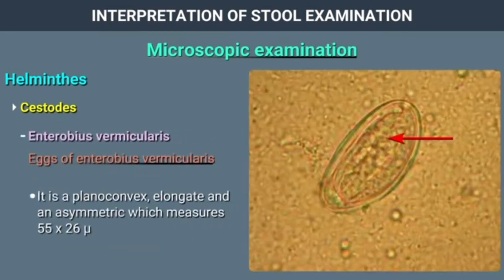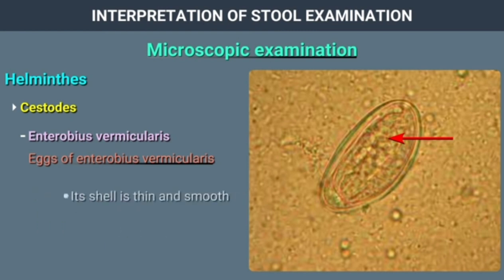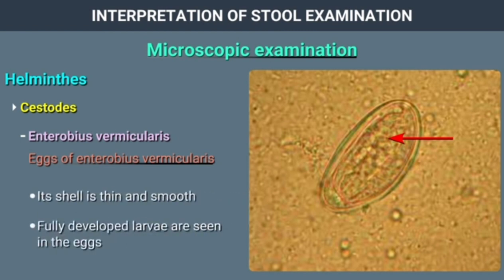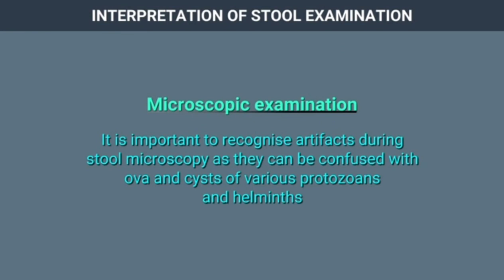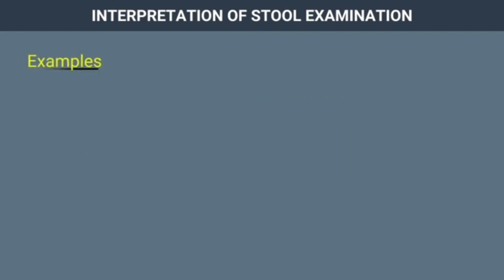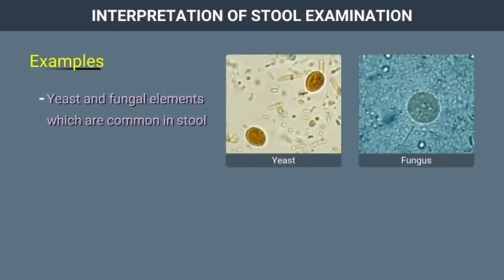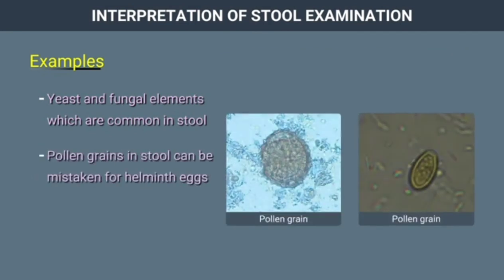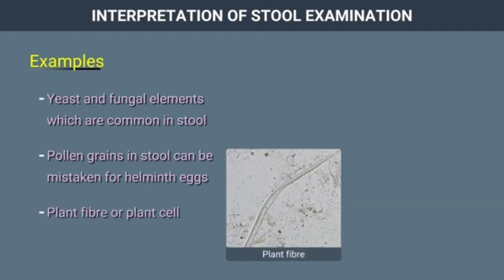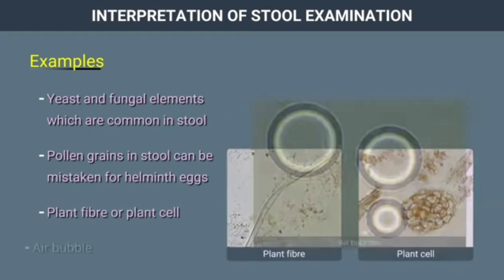Enterobius vermicularis: The egg is plano-convex, elongate, and asymmetric, measuring 55 by 26 microns. Its shell is thin and smooth, with fully developed larvae visible inside. It is important to recognize artifacts during stool microscopy as they can be confused with ova and cysts of various protozoa and helminths. Common artifacts include yeast and fungal elements, pollen grains, plant fiber or plant cells, and air bubbles.